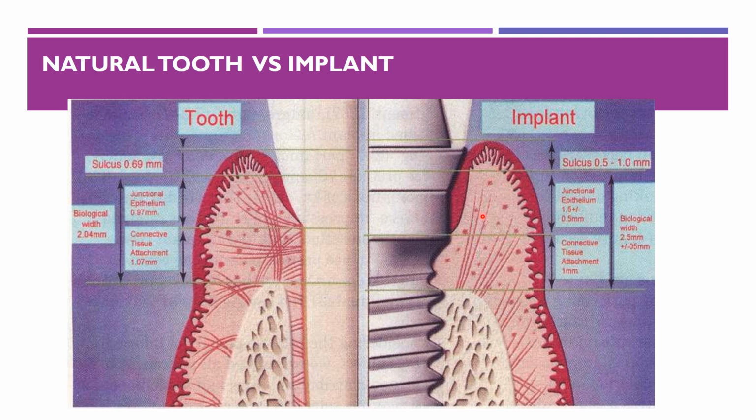Whereas with the implant, you can see that there is no tooth surface, cementum is not there, and periodontal ligament fibers are not there. So the bone is directly attached to the implant surface without incorporation of soft tissue. That is what osseointegration is. Also you can see that the fibers are parallel to the implant surface, whereas here they are somewhat perpendicular to the surface. Here it is more parallel, which enables the penetration of the probe very easily.